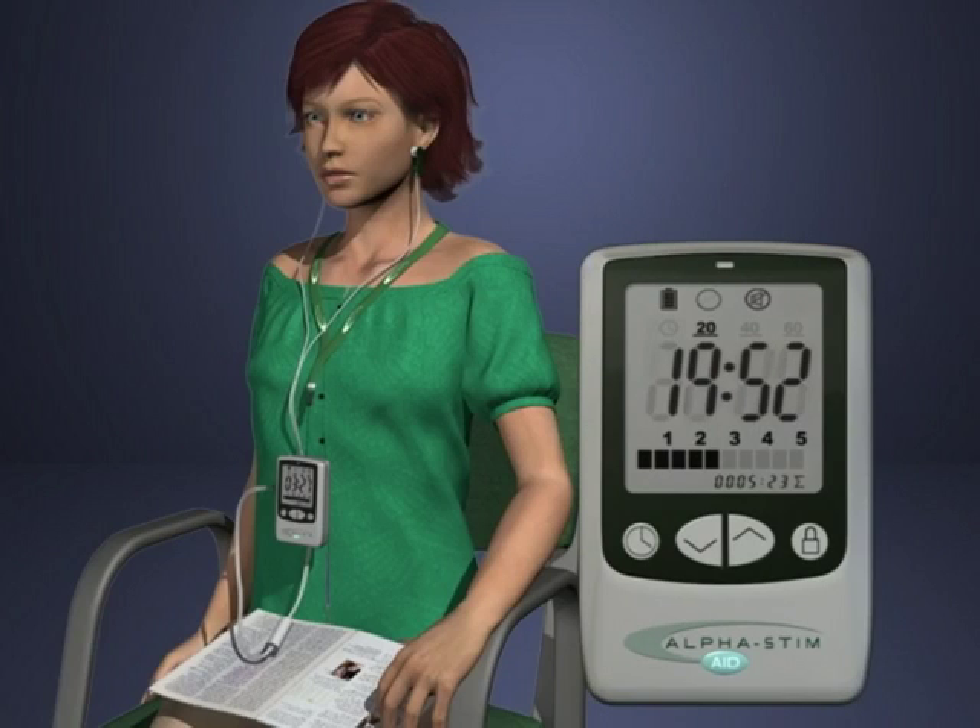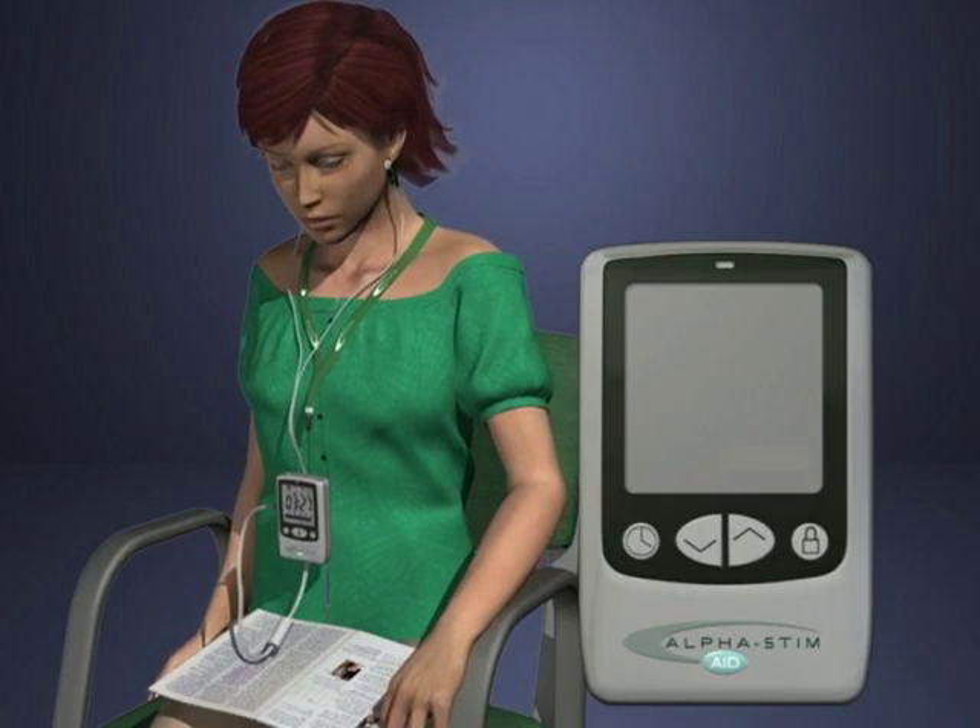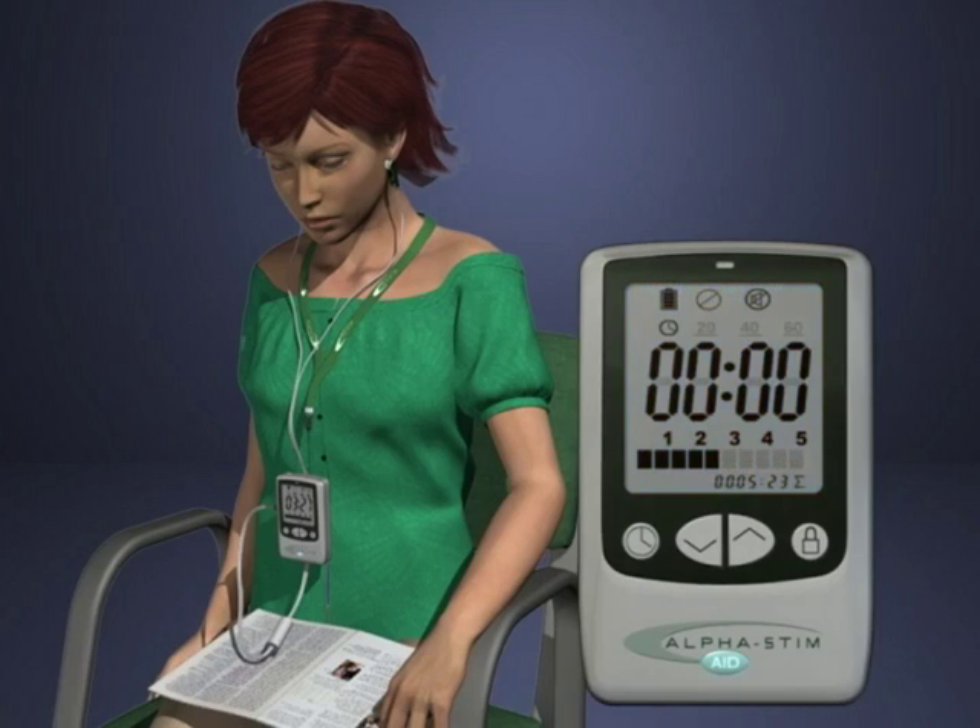Always complete a cranial electrotherapy stimulation session. When the timed session ends, if a heavy feeling is still experienced, resume treatment until at least two minutes after the heaviness lifts and a light feeling develops.